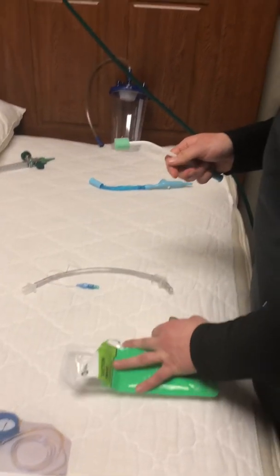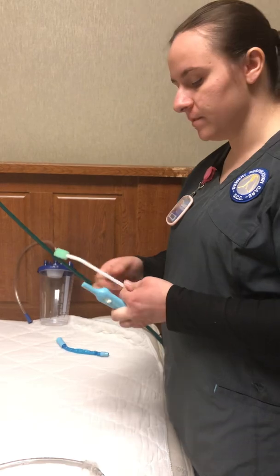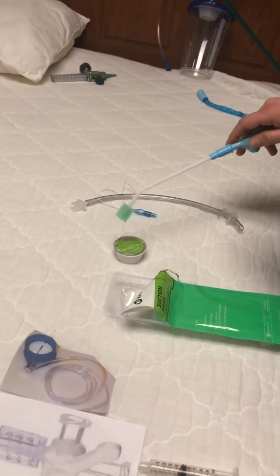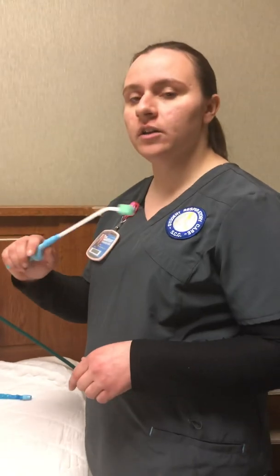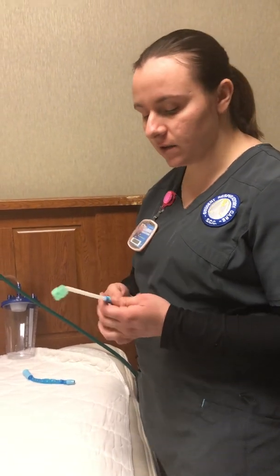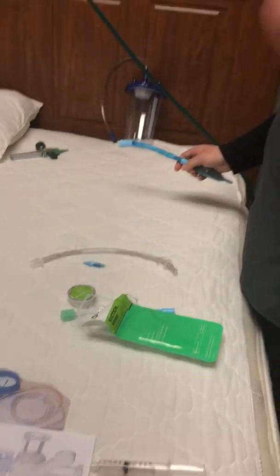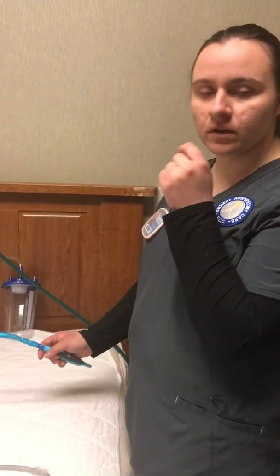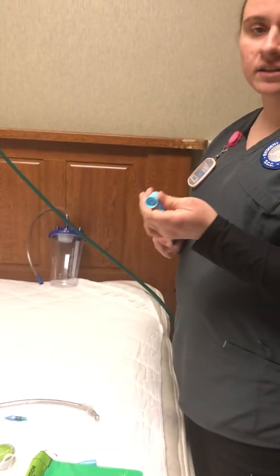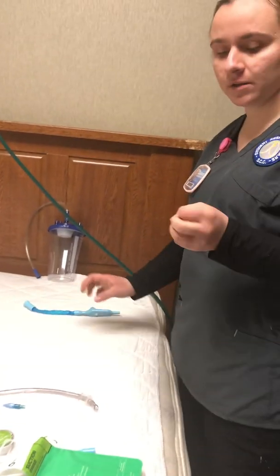So you want to do oral care with a patient with an endotracheal tube, anything like that, every 2 hours. So what I'm going to do is put this in a protective area and attach your oral care swab, so you don't have to have the suction on right away. You're going to dip it into your oral agent, and you're going to do the side of the cheeks and around the gums and back of the tongue and everything. And then this one you can suction out with this one and get any of that excess stuff. And you're going to dispose of that. And then you're going to put your Yankauer back on, and then you're also going to do your moisturizer. So you're going to make sure everything's moisturized, like your lips, everything is nice and moisturized, because the oxygen in their mouth can get quite dry. So if you see any excess stuff that needs suction, always suction that out, so that when you do your cuff care, they don't aspirate anything.